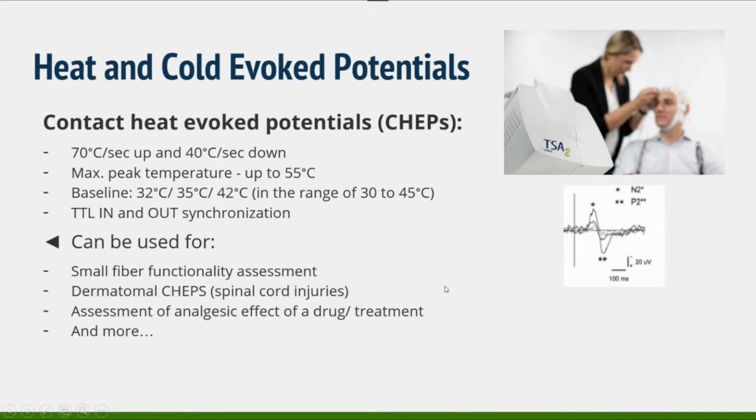So we need to let EEG know when the stimulation started. And this can be done with sending TTL out to EEG device or with starting the stimulation by TTL in sent by EEG device to our TSA2 device. So really many options and any protocol you would like to follow, you will be able to do that.